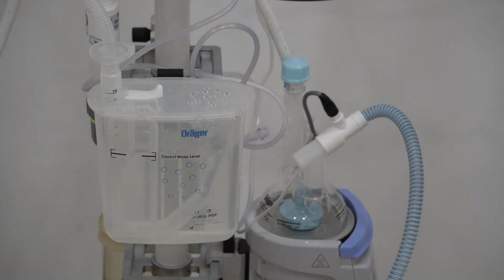I mean, we talked about the importance of delivering humidified and warmed air because of the immaturity of the respiratory system of the neonates and also potential damage that is associated with ventilation with dry air.